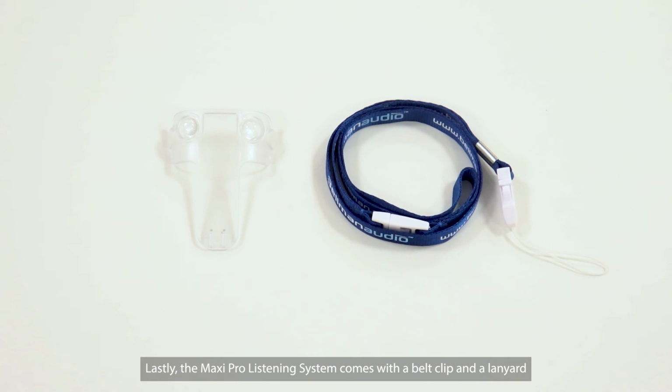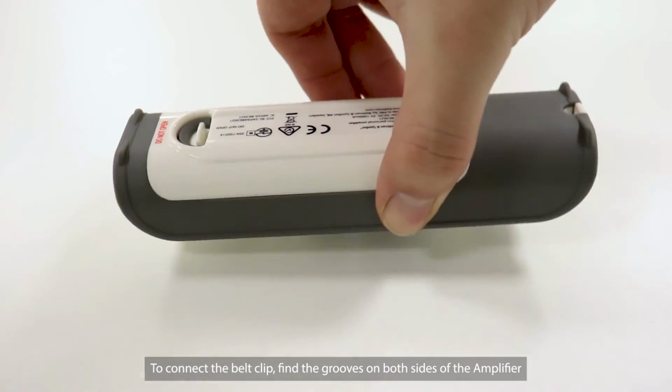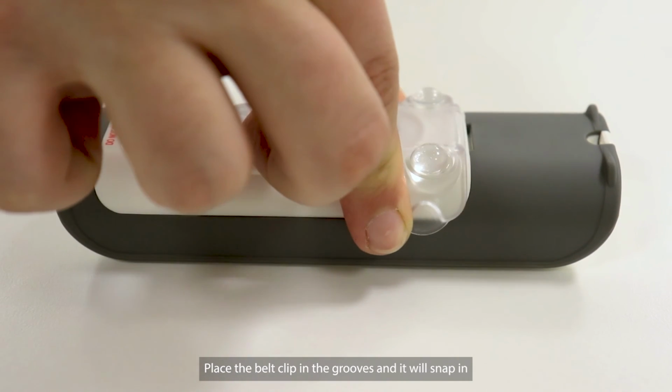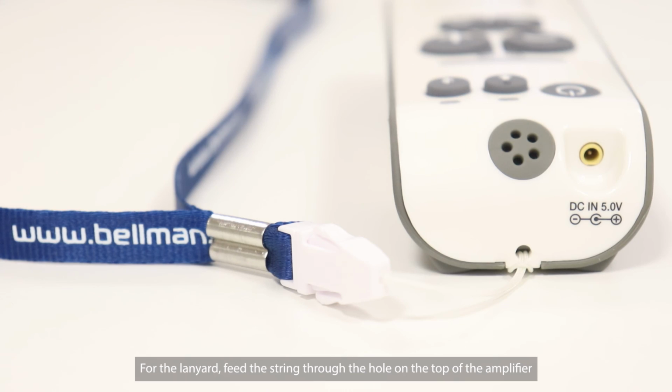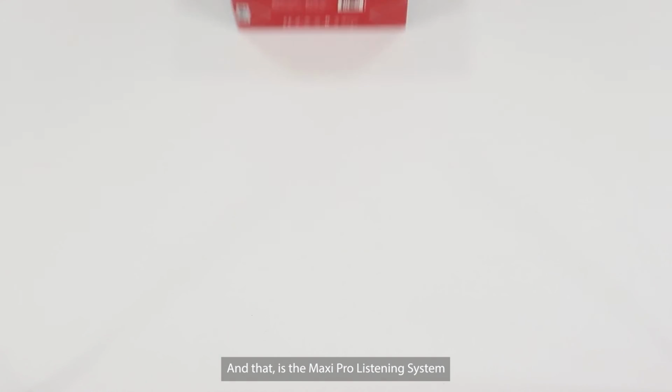Lastly, the Maxi Pro listening system comes with a belt clip and a lanyard. To connect the belt clip, find the grooves on both sides of the amplifier. Place the belt clip in the grooves and it will snap in. For the lanyard, feed the string through the hole on the top of the amplifier. And that is the Maxi Pro listening system.